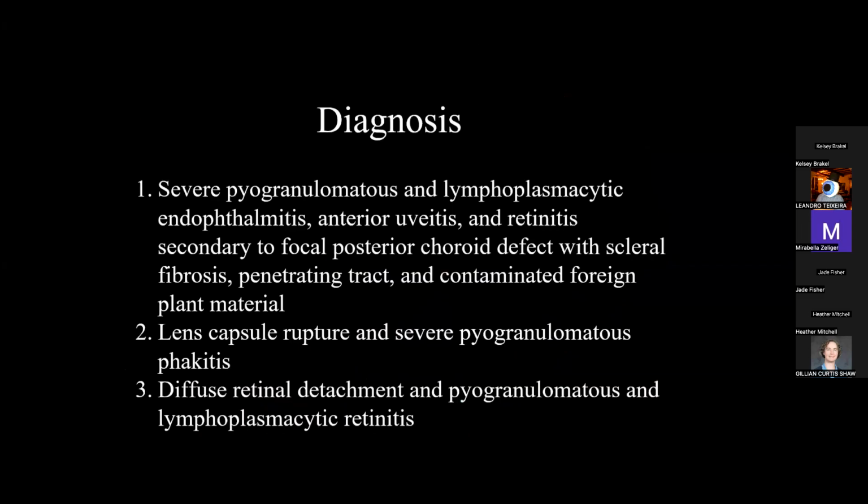Yep. So severe pyogranulomatous, lymphoplasmacytic endophthalmitis, anterior uveitis, retinitis, with that focal defect in the posterior choroid and sclera, consistent with the penetrating tract and the contaminated foreign plant material. Lens capsule rupture and the retinal detachment and inflammation. So, given that it was coming from behind the eye, maybe it came up from the oral cavity.